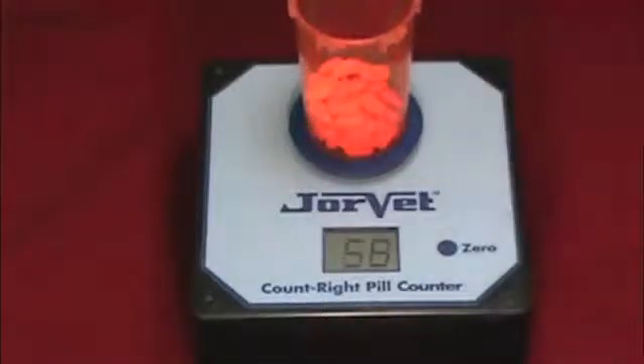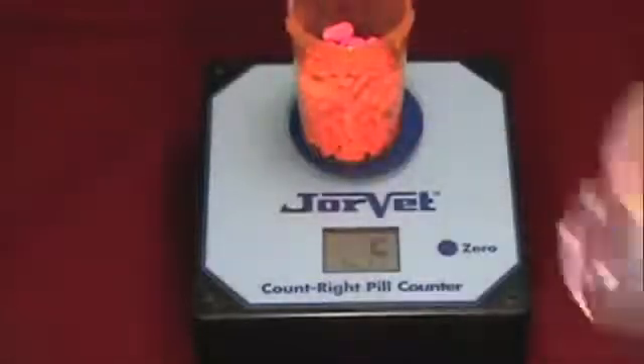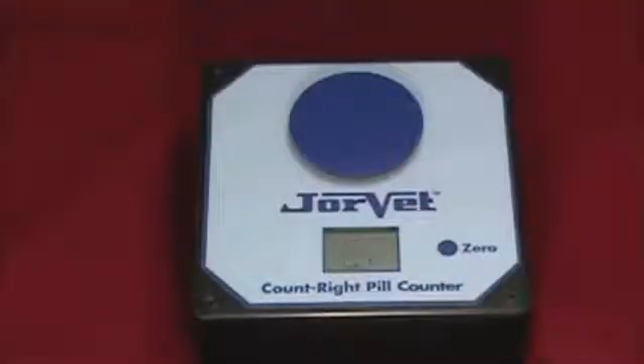The display will blink as it determines the count, then stop blinking when it is ready for more. If you add too many, the display will show ER for error, and you will have to pour some pills out to continue counting.